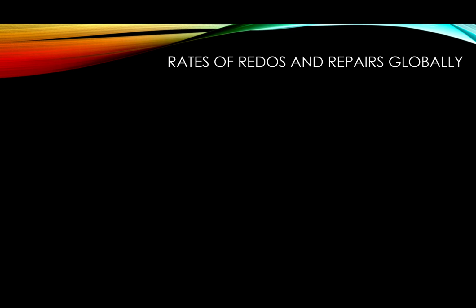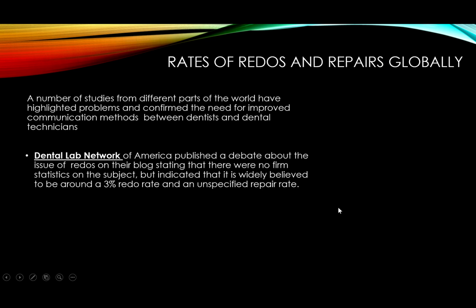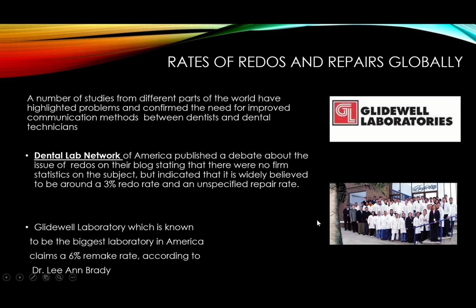Let me take a look at the rates of redos and repairs globally. Do we have any numbers? I couldn't find many numbers, but for example, Glidewell Laboratory did not publish, as far as I know, its own redo and repair rates, but I got this from a blogger, I think, or from an article.